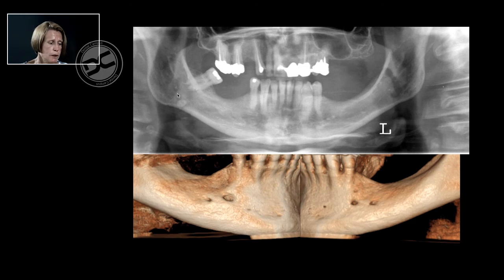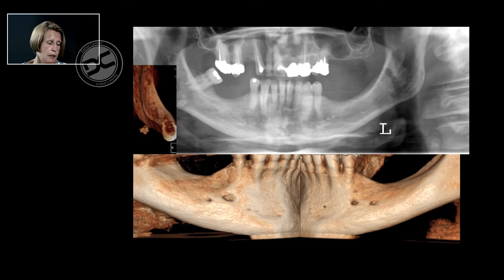Another issue which may have been overlooked is the position of a salivary gland stone. This stone was present at the lingual ramus site, and it could be detected at the same time that the scan was taken for planning the implant surgery and for identifying the mental foramina.